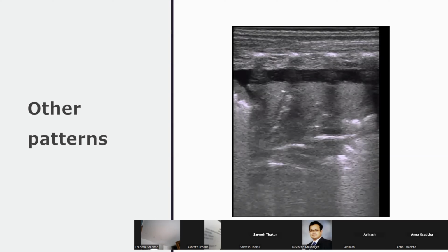And would you consider tapping this baby, the effusion? We'll talk about this in the lecture Thursday after next, really, how you determine which of these aspects. You might have atelectasis with a significant effusion. The question is, would you tap versus not? Again, the clinical profile of the baby is quite important. If it's hydrops in the delivery suite with massive pleural effusions, yes, absolutely, because the risk there is my lungs are completely atelectatic because of the severity of the effusion.